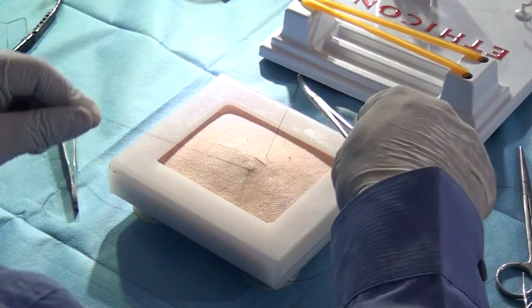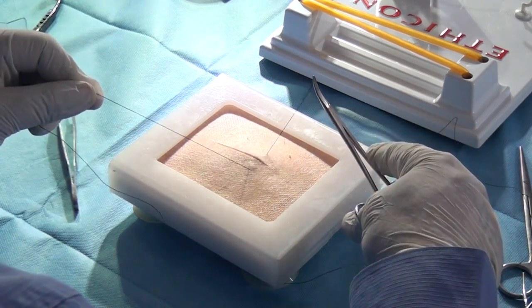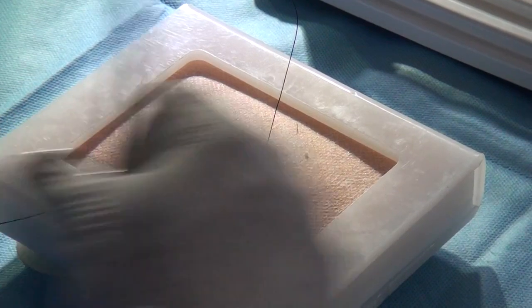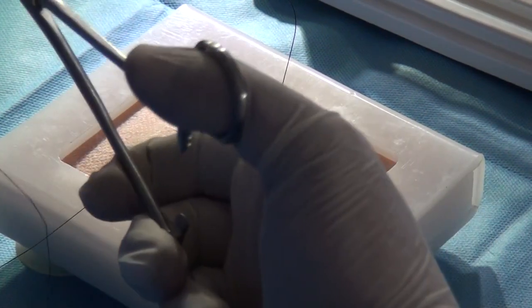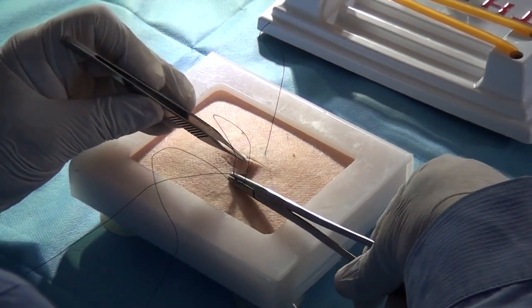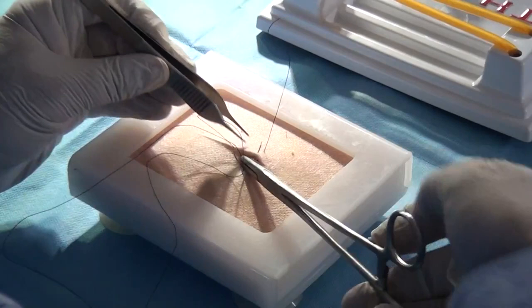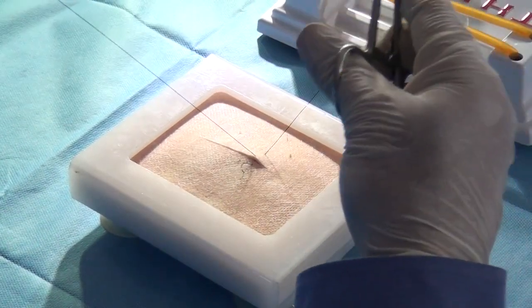And this is the bite of the suture I've taken. It is a simple suture where I've gone twice the depth of the wound on either side and taken a bite. If I go back to get good cosmesis and also hemostasis, I'll call it a mattress suture. On the same axis, I take a superficial bite which closes the dead space. This is vertical mattress. If I go parallel, it will be horizontal mattress.